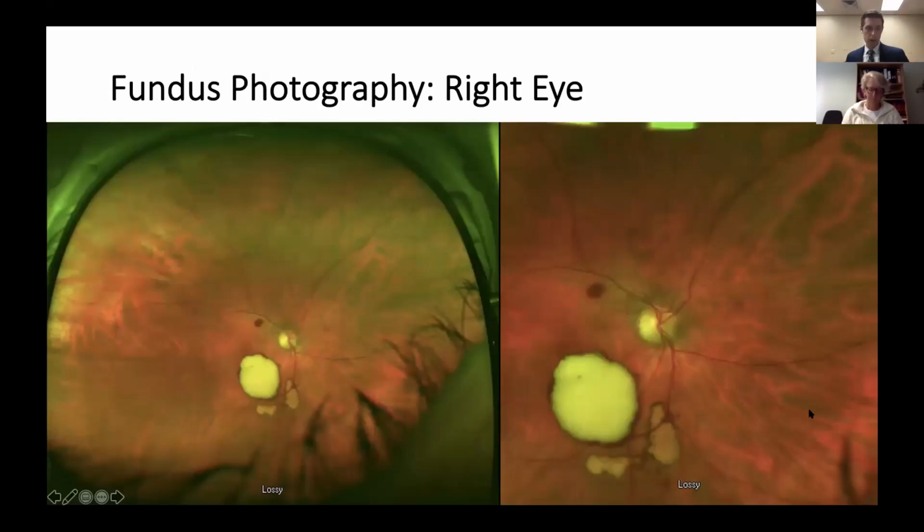Here's the Optos fundus photography. This is the right eye with a wide field on the left-hand side of your view, and then a zoomed-in photo, more of the macular focus. On the left-hand side, you can see more of this kind of just large dot blot hemorrhage by the superior arcade, somewhat indistinct border of the disc without any classic clear disc edema.